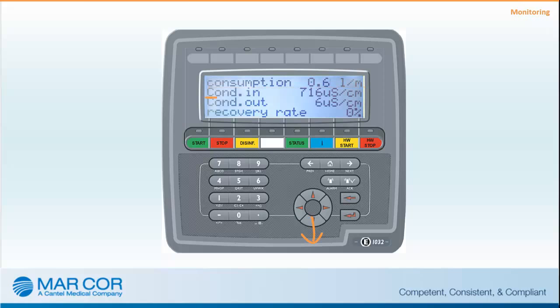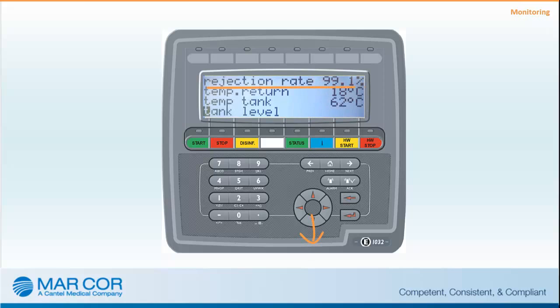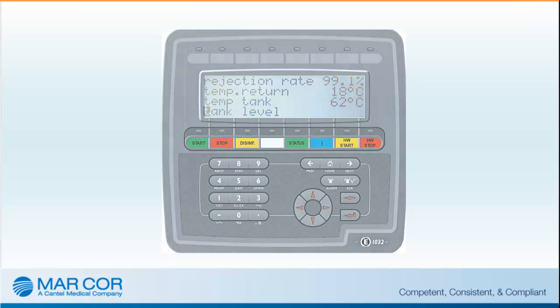Additional parameters available include product water consumption, conductivity in, conductivity out, recovery rate, and rejection rate. Also available are temperature return, tank temperature, and tank level. A log sheet is included in the Operator's Manual that can be used to record this information; otherwise, record information as specified by facility policy and procedures.